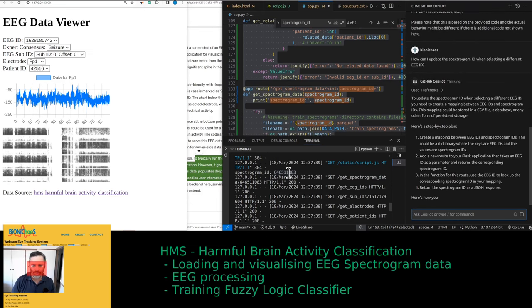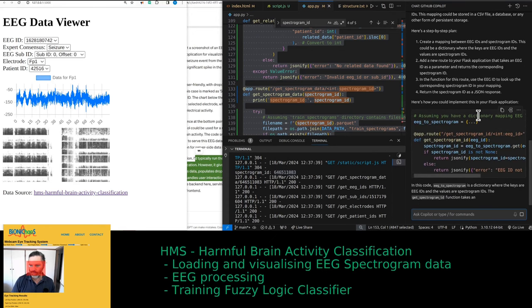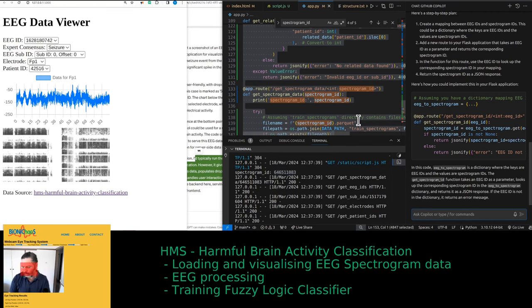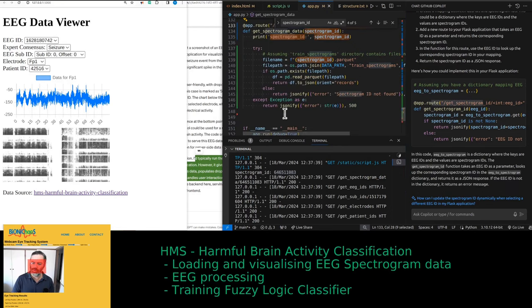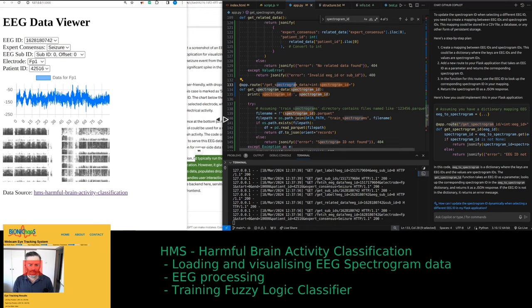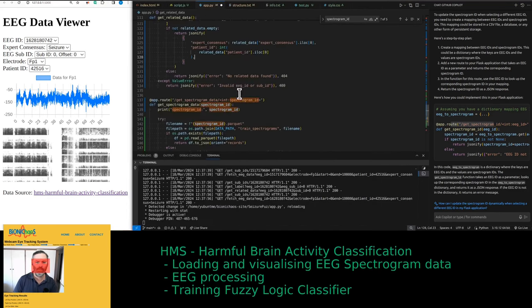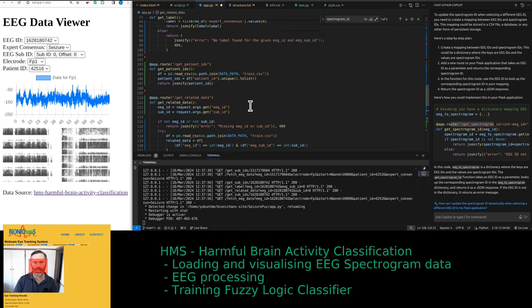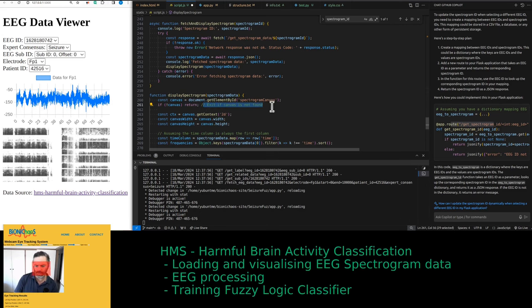We need to not just print the spectrogram ID in the back-end — we might want to display it on the front page. We should create a mapping between EEG ID and spectrogram ID. We already have a 'get spectrogram data' function but we might get rid of unnecessary comments.